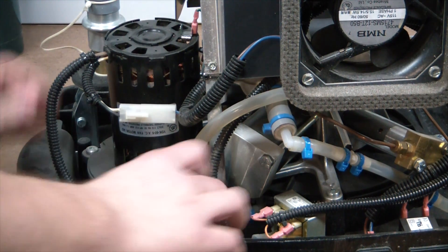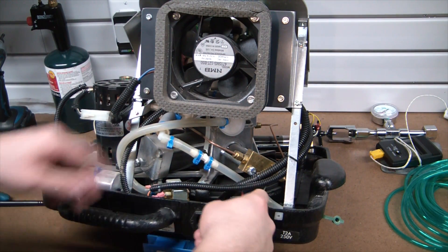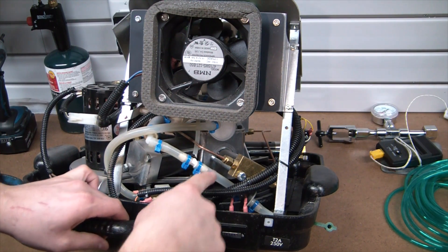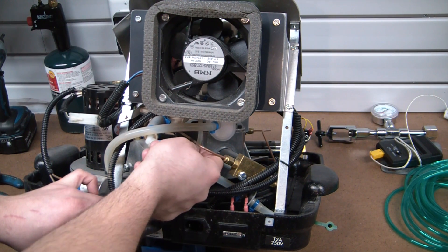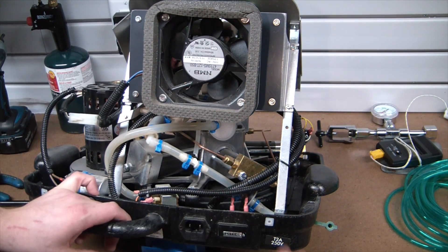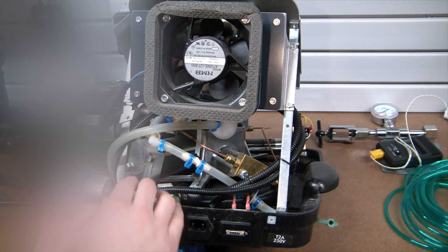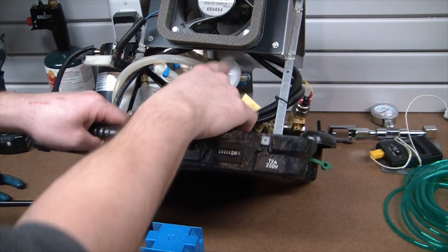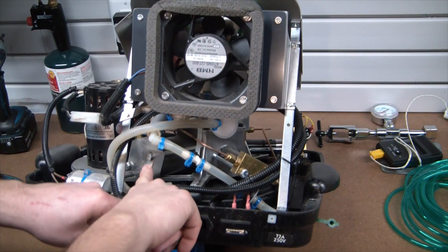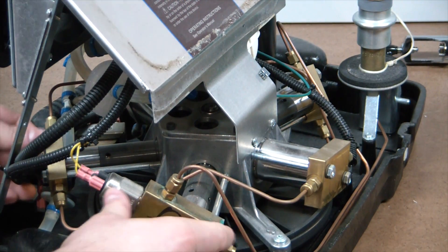Looking at the O2 path: the input comes in through a little particulate filter and tees off — that goes to the oxygen sensor, so it knows the concentration is adequate before filling and monitors it throughout. Then the majority of the oxygen goes into the manifold, which distributes it first through a bacteriostatic filter to stop any little critters from getting into your oxygen tank, and then right to the first manifold stage where it begins to get pressurized.